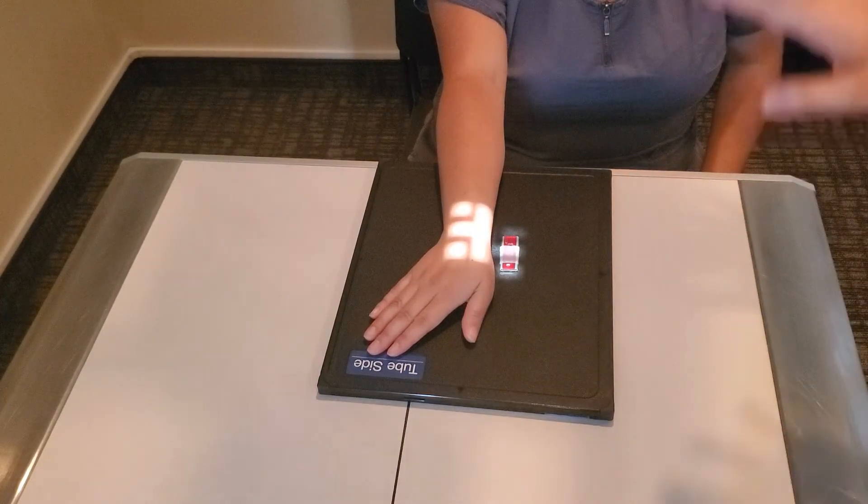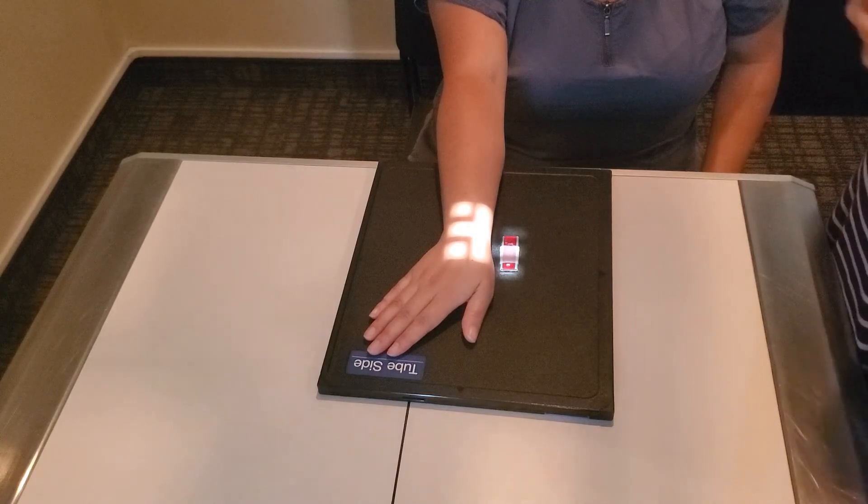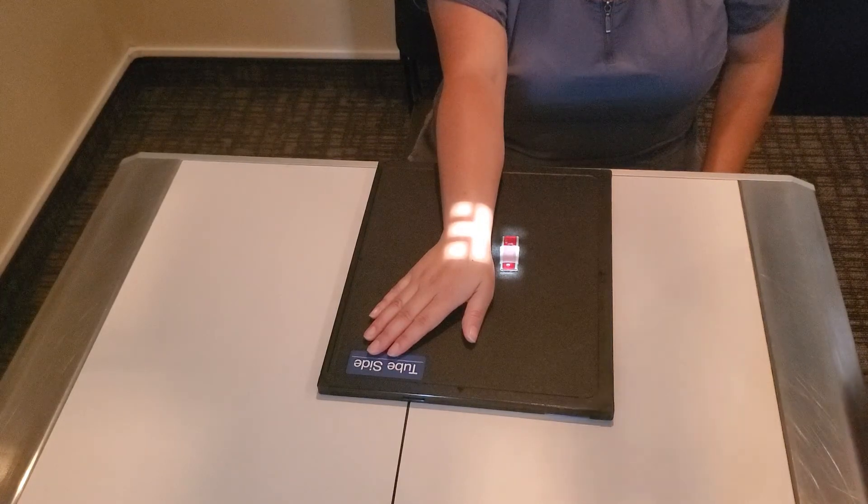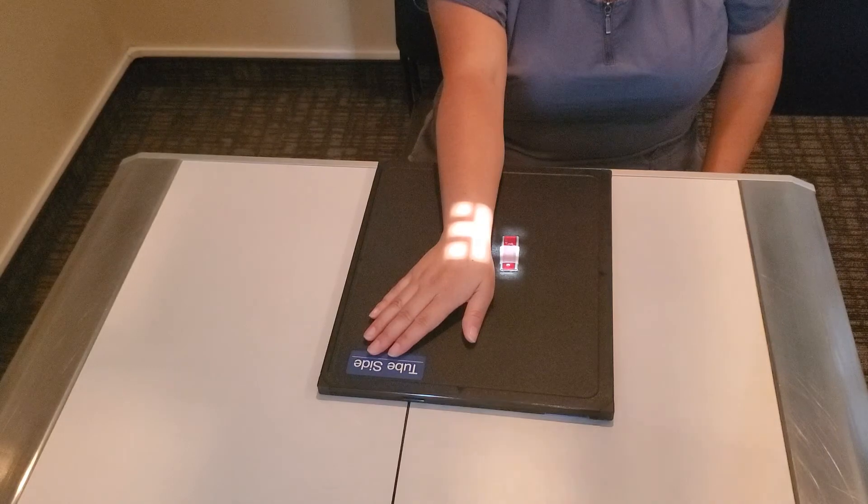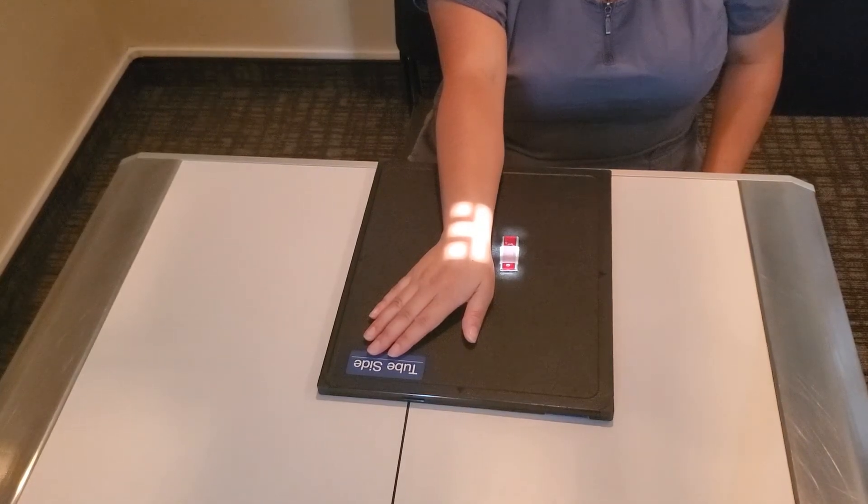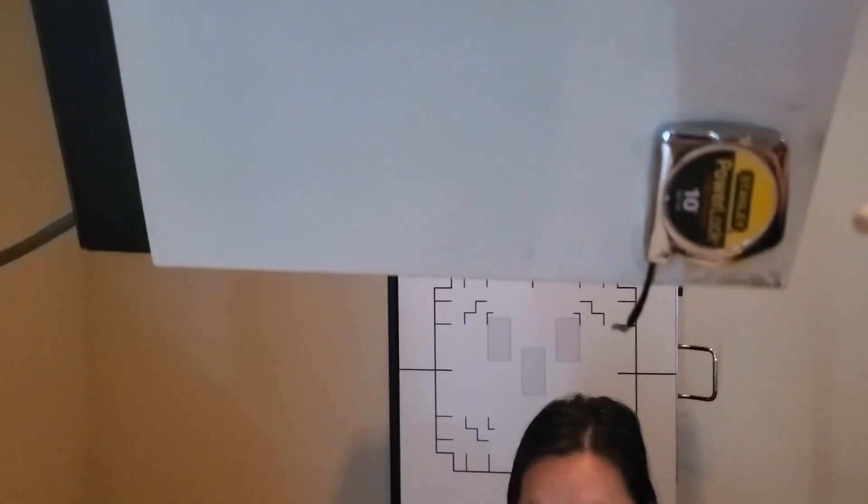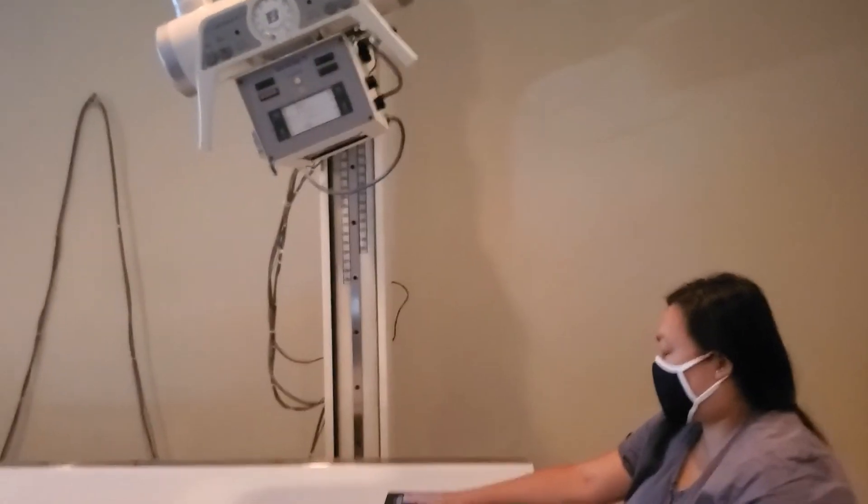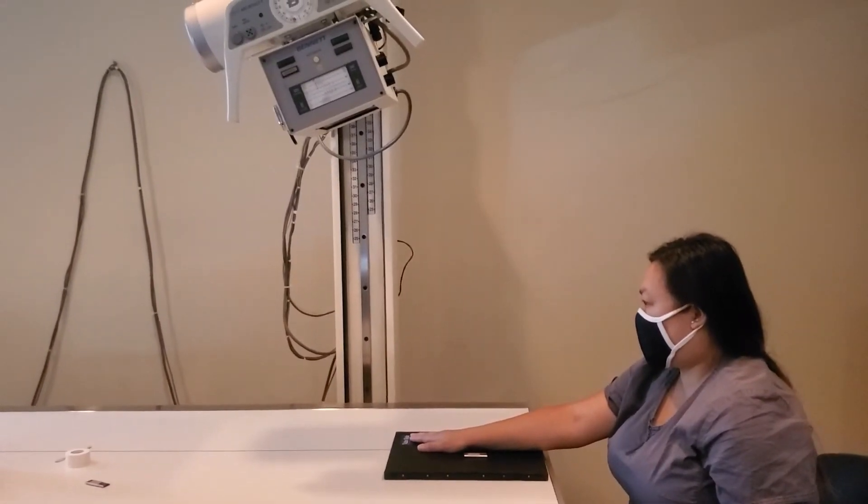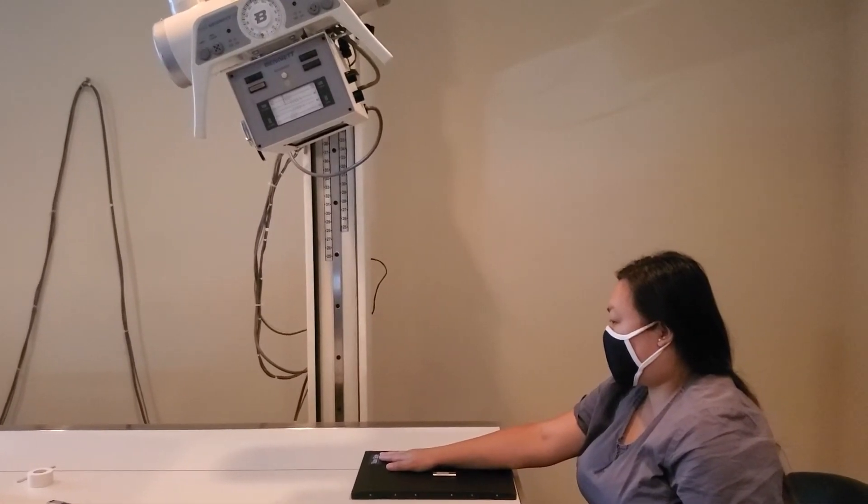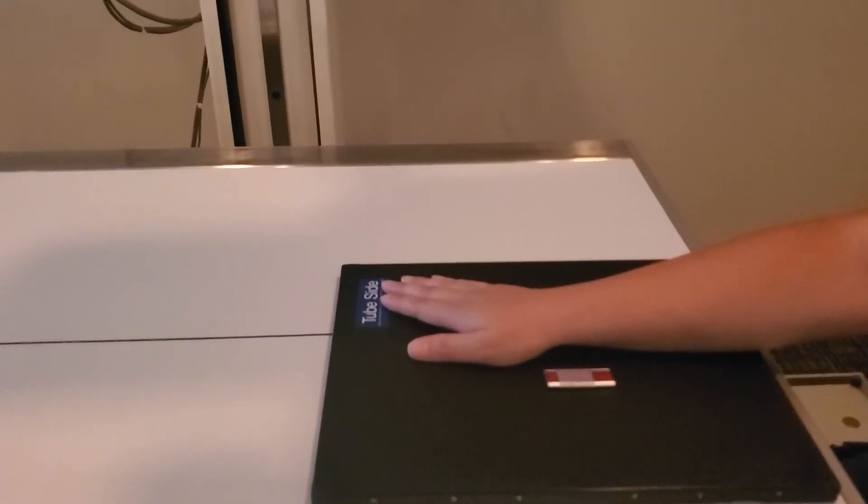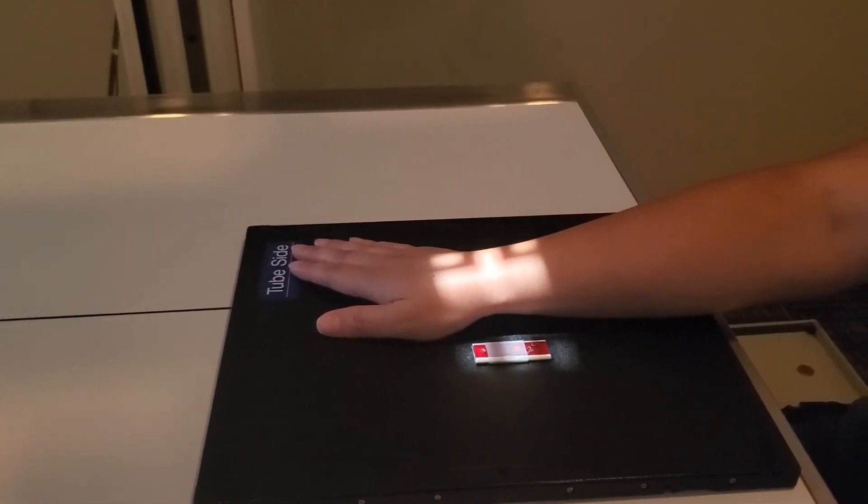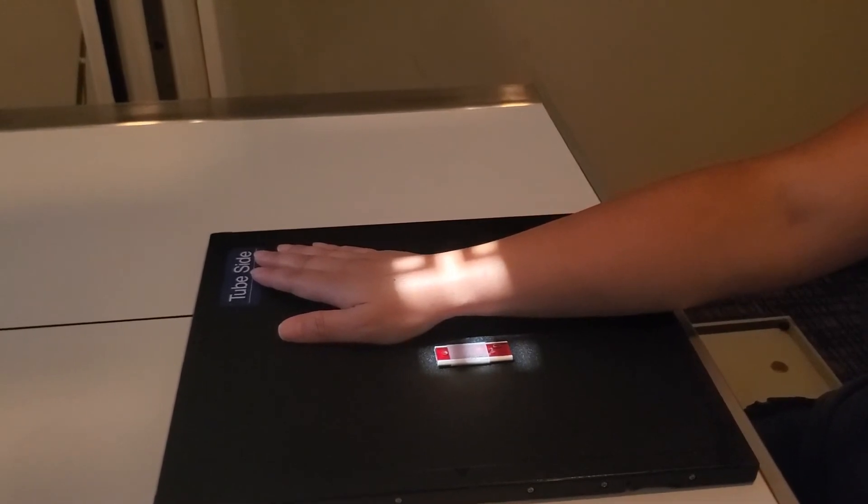And again still close to collimation because we only care about that scaphoid. This angle is going to elongate that scaphoid so it's going to stretch it out so if there's small hairline fractures you're going to be able to see it better because of the angle of this tube. So you're still centering everything the way that it was centered for your last exam. It's just now when you're doing it the difference is how the tube is positioned. So from a side view you can see that this tube has that 20 degree angle on it and it's aimed towards that scaphoid. So again still in ulnar deviation going right to that scaphoid projection. This is your Stecher method without the sponge.